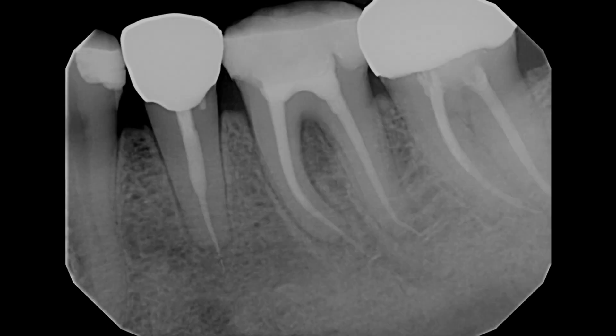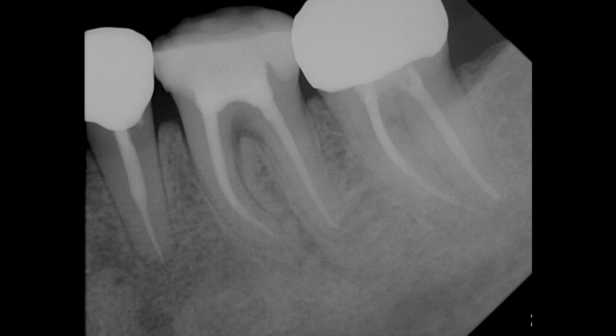Root canal therapy was carried out uneventfully. No horizontal crack lines were noted in the pulpal floor and a sealer puff was achieved on both the distal and mesial roots. On six-month follow-up we can see good bone healing around both root tips and up into the furcation of the tooth, with the new healed bone actually appearing even more dense than the native surrounding bone.